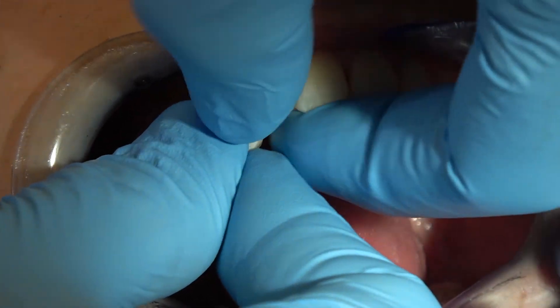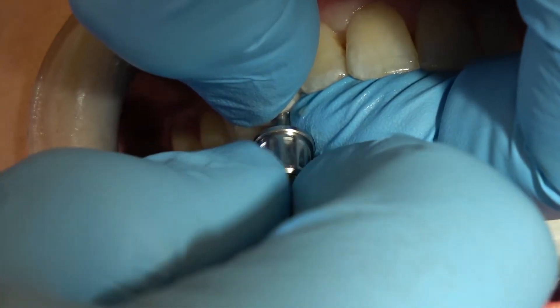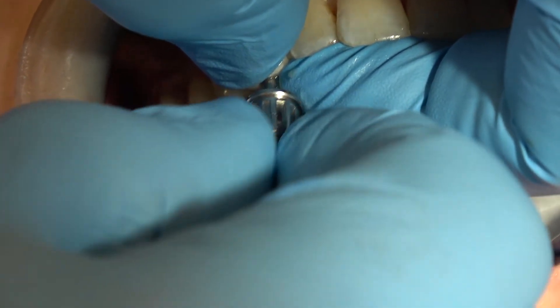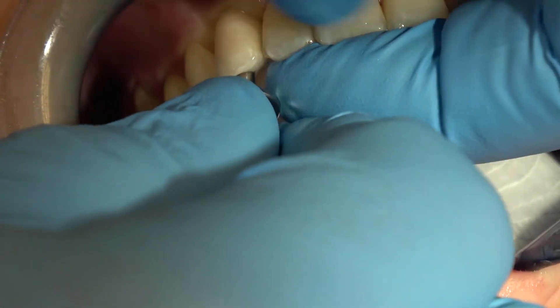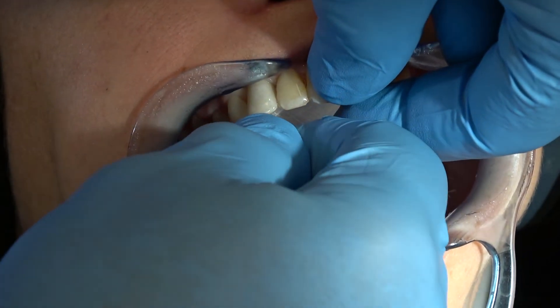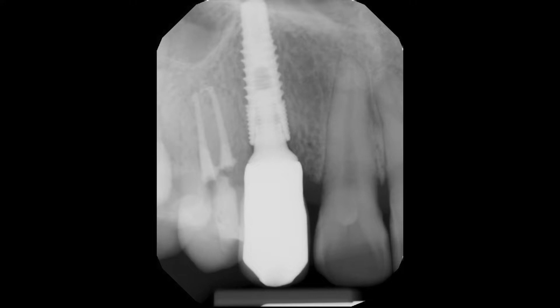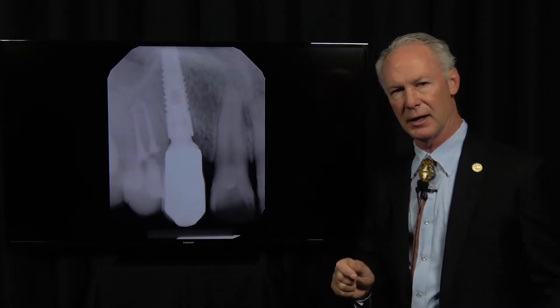I'm trying on the implant abutment and crown, hand-tightening it. Check the contacts — it's just hand-tightened. Here's the radiograph to confirm the seating, and it's going to seat a little bit more once you torque it down to 35 newton centimeters. There's a way to do that so you have the least likelihood of implant screw loosening.